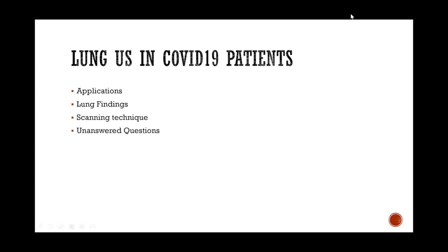Ooh, Dr. Santa wants to know if you give hands-on training. I do give hands-on training. I've never actually done that via webinar, but that's something we could potentially do. And certainly a lot of the video links that I will send you will have a video where you can watch somebody being scanned, which is probably the closest you could get to seeing hands-on training. And so I think that's probably the closest we could do.